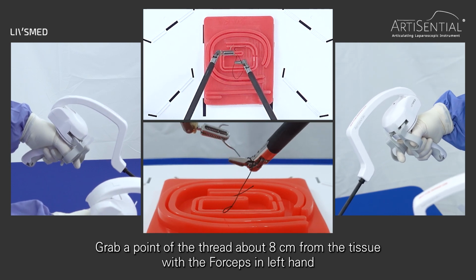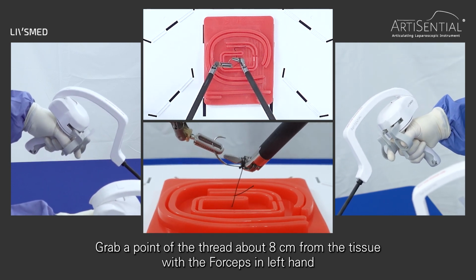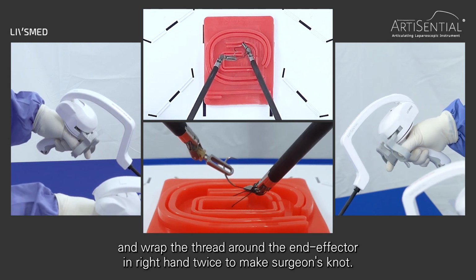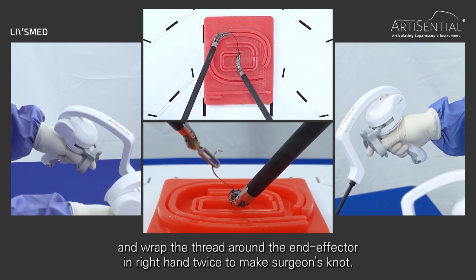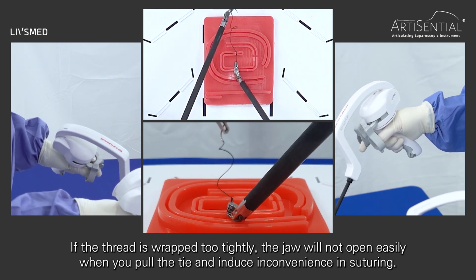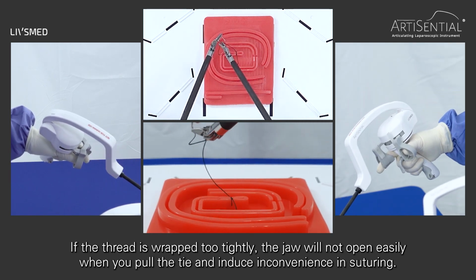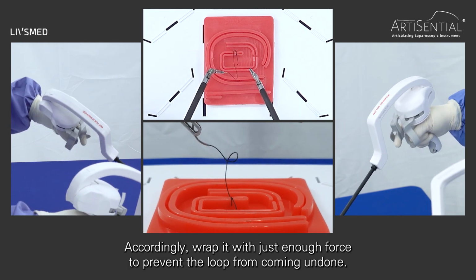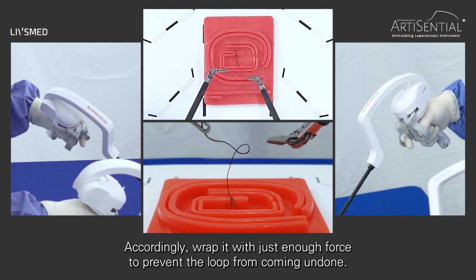Grab a point of the thread about 8 cm from the tissue with the forceps in the left hand and wrap the thread around the end effector in the right hand twice to make a surgeon's knot. If the thread is wrapped too tightly, the jaw will not open easily when you pull the tie and induce inconvenience in suturing. Accordingly, wrap it with just enough force to prevent the loop from coming undone.